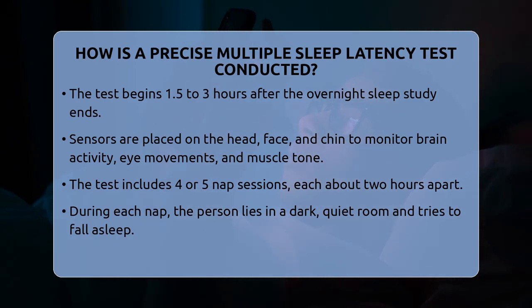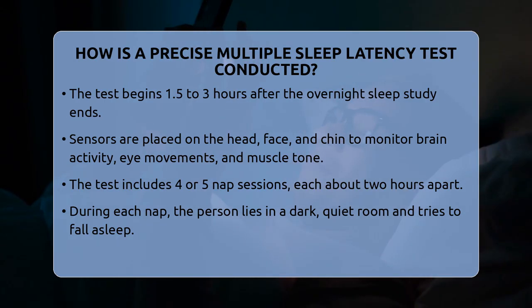On the day of the test, it is done right after an overnight sleep study, which is the usual test for sleep apnea. The MSLT starts about 1.5 to 3 hours after the overnight study ends. Patients are asked to eat a light breakfast first.